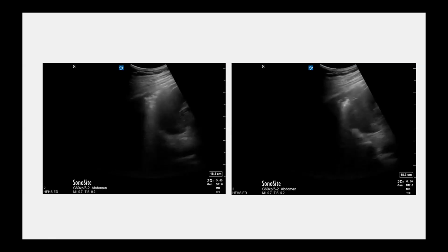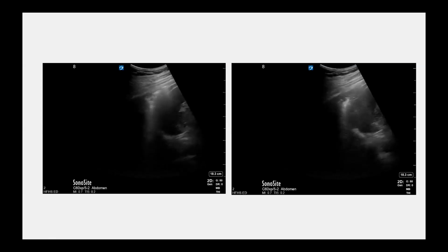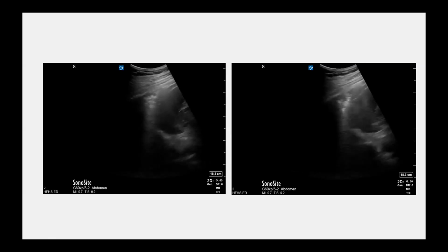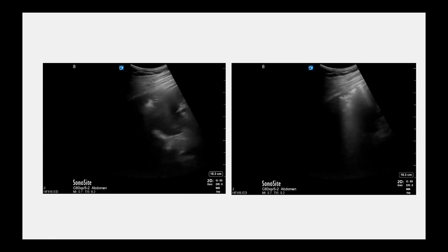Sorry, one other thing I want to point out too is, we're at an 18 centimeter depth right here. So once you get your picture evaluating for B lines, if there's an area of lung that you're concerned about, one of the things that you can do is decrease your depth just to look at that area of concern. So for this case, if you brought your depth down to maybe like 10 centimeters, it's based on what you're trying to evaluate. The resolution of this costophrenic recess is going to increase, and you're going to see more detail in that subpleural consolidation as well. Very important point.